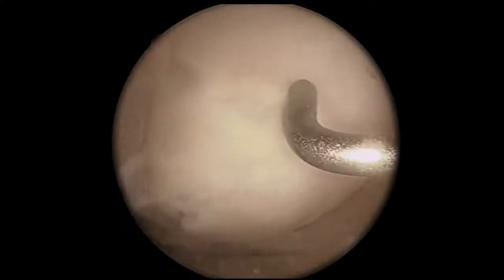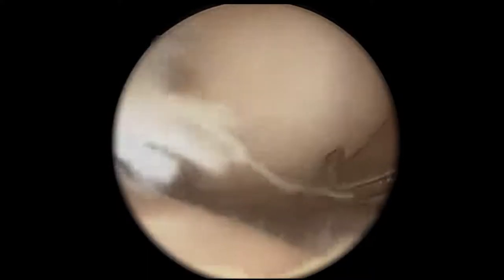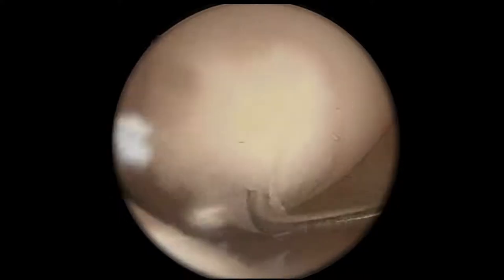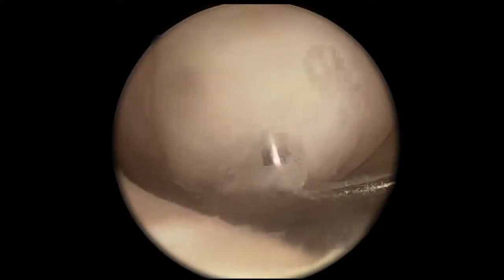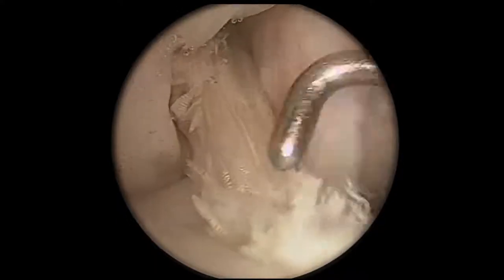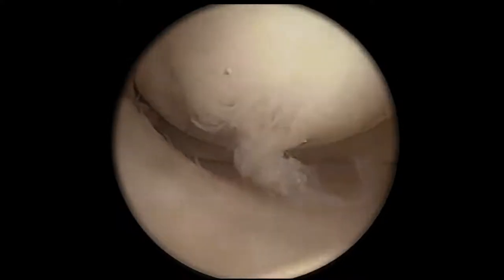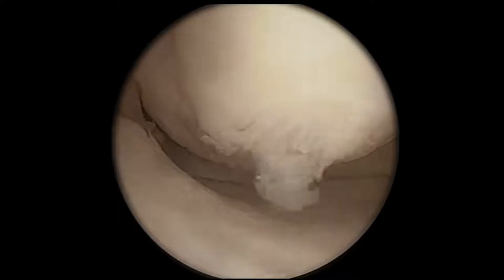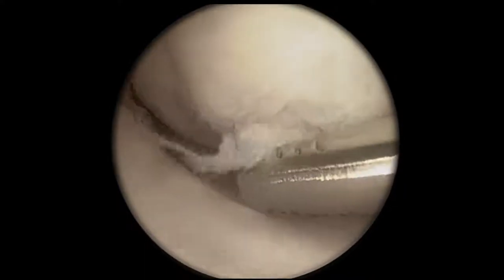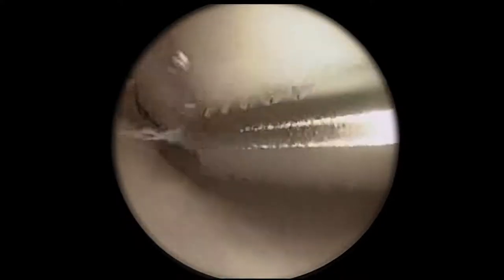We can see her medial femoral condyle lesion. This is all fibrous tissue which has filled in and extends all the way to the back. I'm showing here with the probe the area around the lesion itself — the front, the medial aspect, and the posterior aspect. There's our ACL graft, which is intact. You can see all this fibrous tissue sitting within that medial lesion. Here's the shaver — we're cleaning it up, removing the fibrous tissue to get an idea of the size.